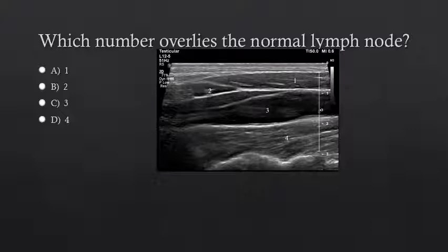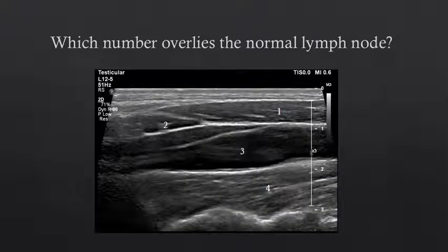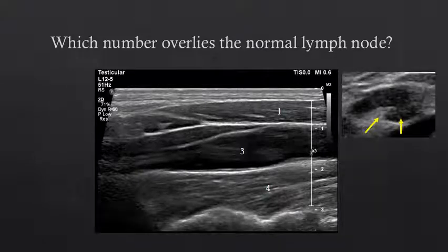Now orient yourself to this image and decide which number overlies the normal lymph node. Number one overlies a muscle. Number two overlies a small lymph node with an outer hypoechoic cortex and an echogenic fatty hilum. Number three overlies a vessel, and number four overlies a muscle deep to that vessel. When we look more closely, we can see that central echogenic fatty hilum with the smooth hypoechoic cortex. For comparison, here's another lymph node with an echogenic fatty hilum and smooth hypoechoic cortex.